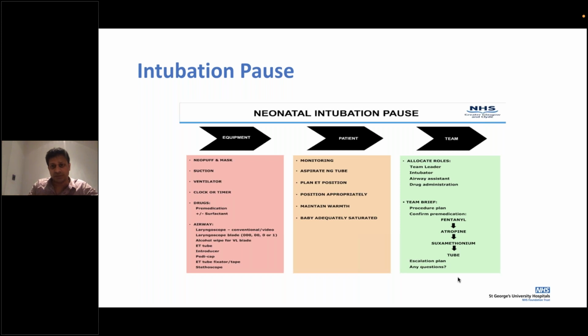There is a facility within your incubator to raise it up completely, or even cover the baby so that just the head end is open, and you cover the head with a hat in preparation, and then proceed with your intubation.